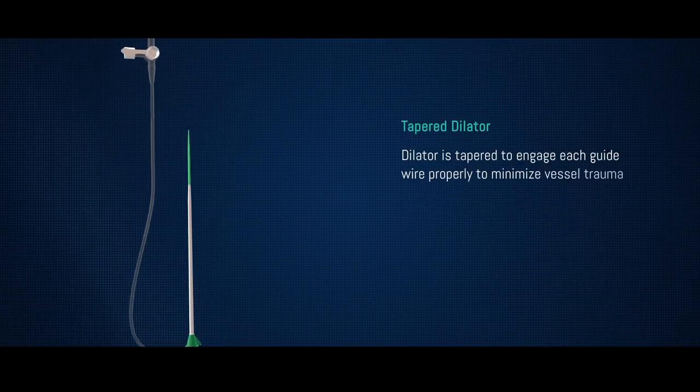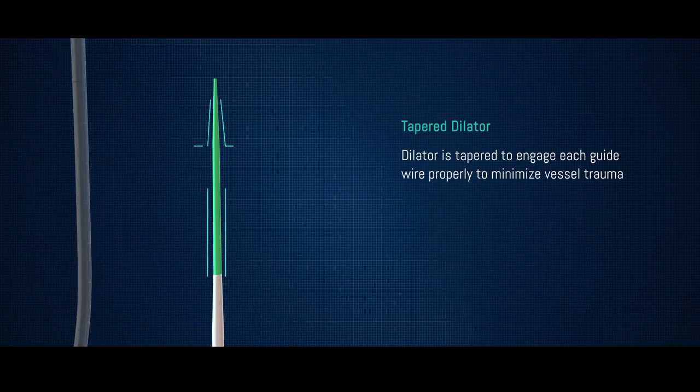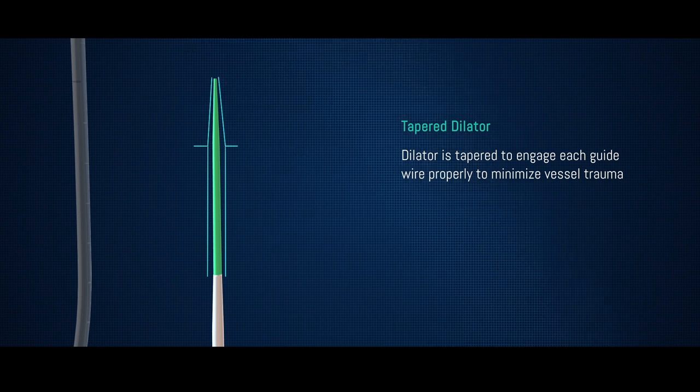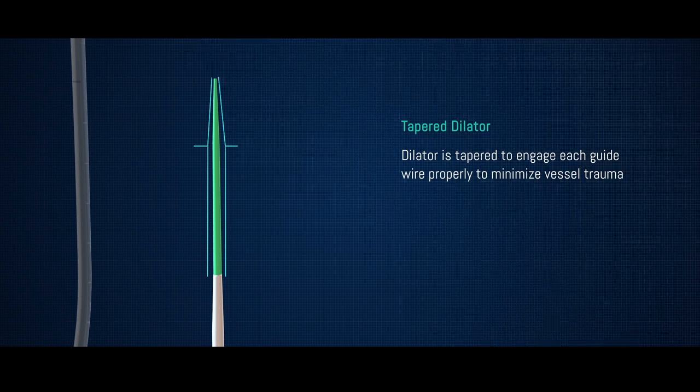The dilator is tapered to engage each guide wire properly to minimize vessel trauma.